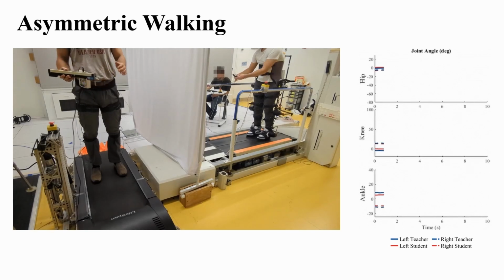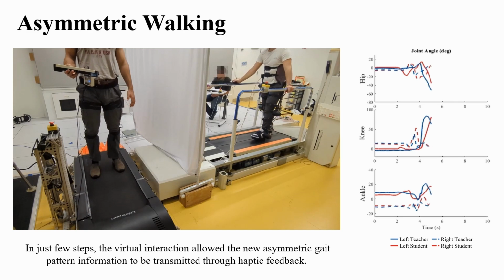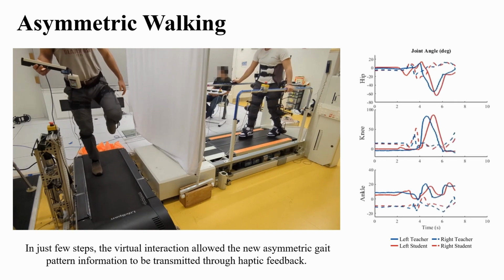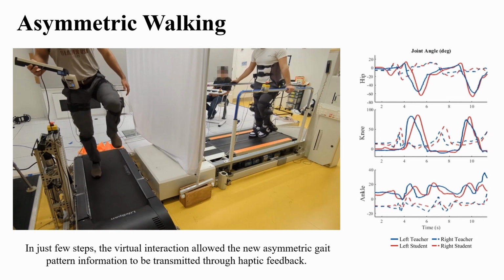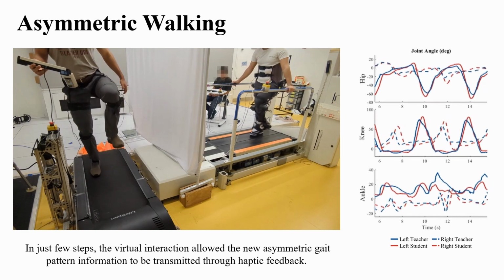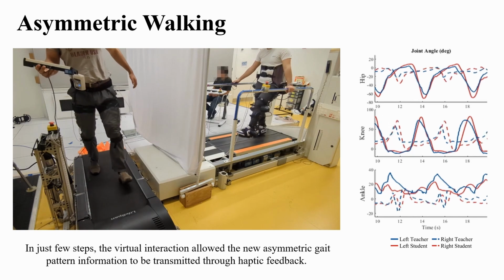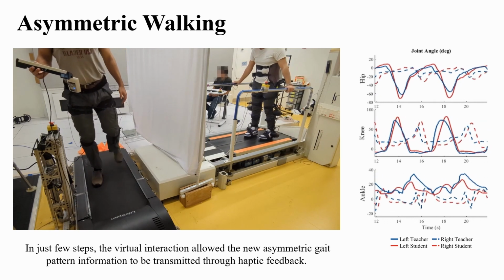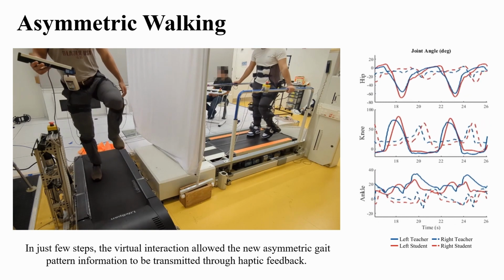In the second scenario, we use the stiff interaction to demonstrate how the teacher can transfer an asymmetric walking pattern to the student. While walking on the treadmill, the teacher exaggerated the movements of the left leg compared to the right. The student was instructed to follow the haptic forces they experienced. In just a few steps, the virtual interaction allowed the student to perceive and adopt the asymmetric gait pattern, without visual feedback of the teacher or prior knowledge of this new pattern.